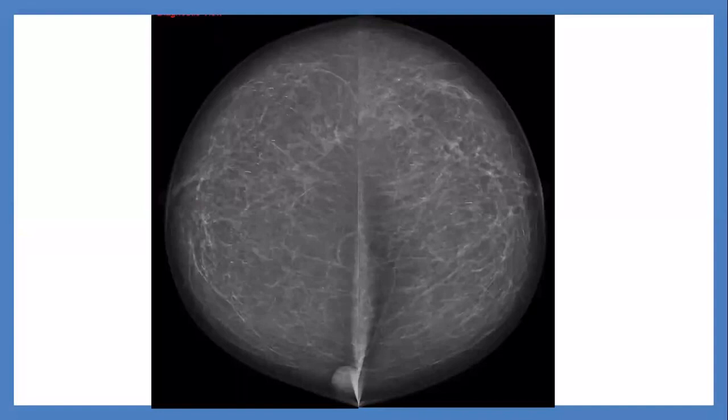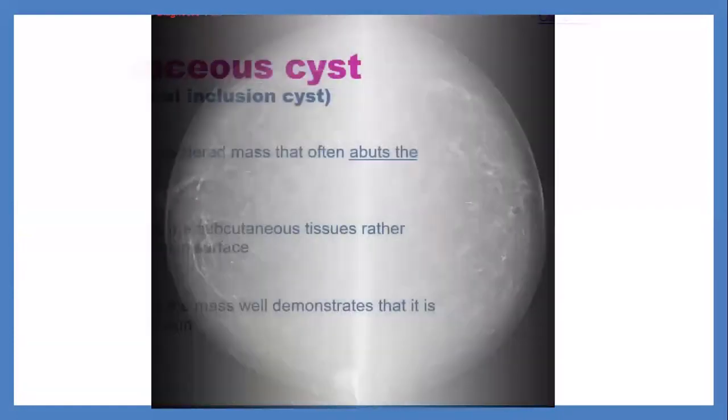So next I will go for... It was not seen on MLO. I will do tangential views. Okay. Not done. You have to do cleavage views. Ultrasound. Okay. Cleavage.